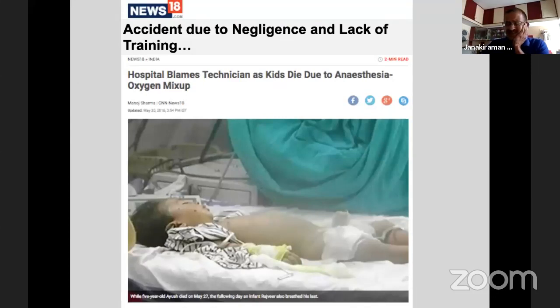I got around hundreds of clips like this. Every time I see, I only get frustrated. The nitrous and the oxygen got mixed up. And instead of oxygen, the nitrous oxide was going to the patient.